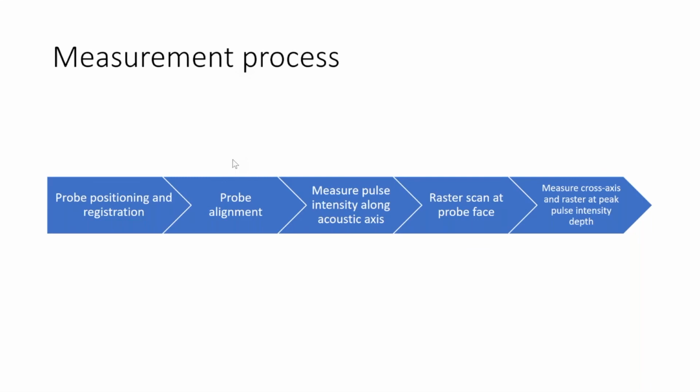There are no requirements to directly, continuously monitor a device through its clinical life, although it is worth pointing out there are no absolute guarantees, but the most common things that go wrong with clinical systems in utilization will tend to make the acoustic output go down, so that the concern over what happens with systems over clinical life is more one of clinical accuracy and clinical effectiveness, and not so much a concern that you'll be exposing patients to excessive acoustic output.